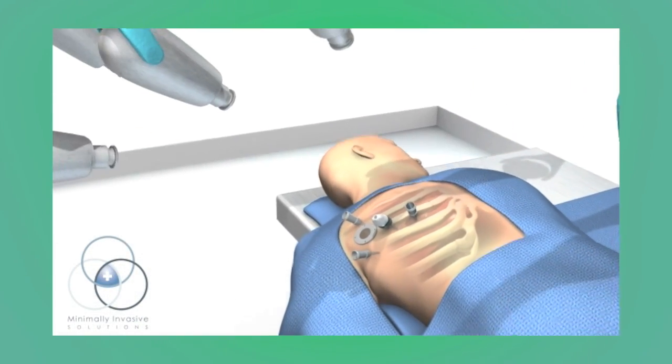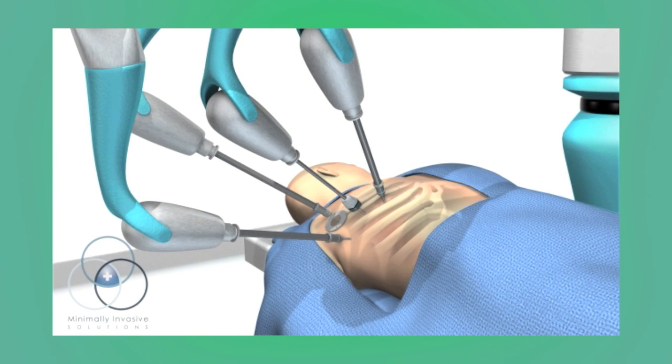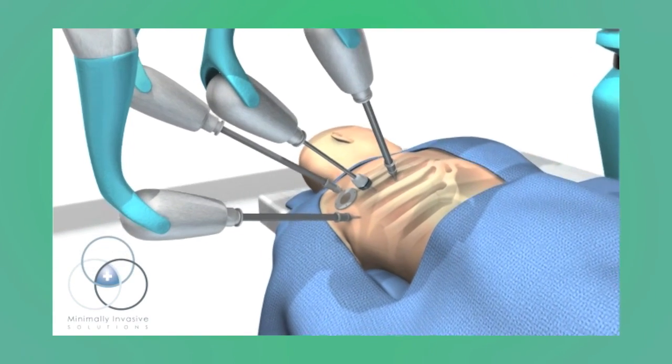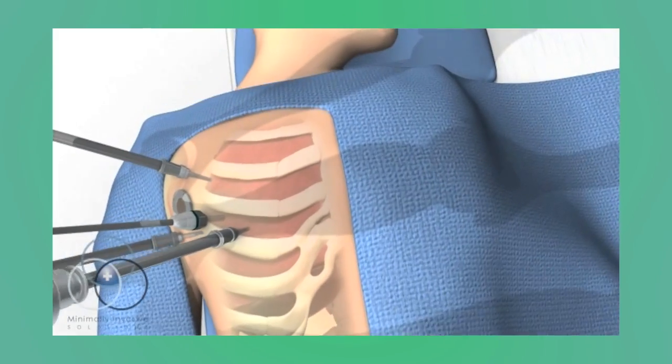The surgeon attaches the robot to the patient through thin tubes called trocars. These allow the instruments and camera to glide smoothly during the procedure.